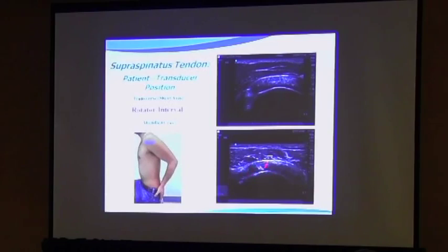And that rotator interval is very important to look at because it comprises a large percentage of rotator cuff tears.